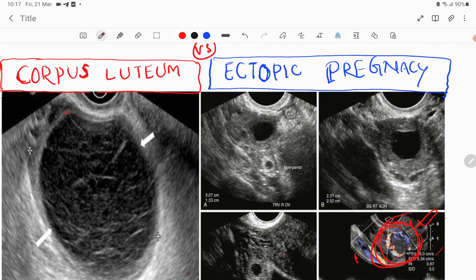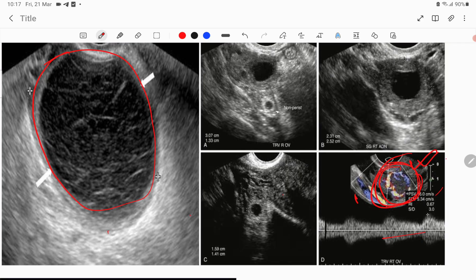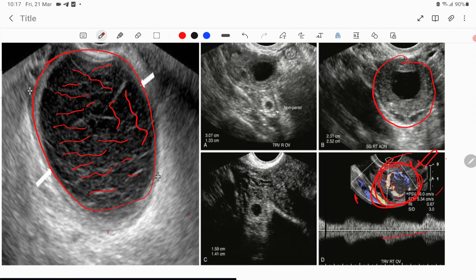Here you can see a corpus luteum with a ruptured hemorrhagic cyst — there is an interlacing hemorrhagic net-like pattern inside. Because of hemorrhage, there is a net-like blood clot pattern inside the cystic structure. You can also see an ectopic pregnancy with a thick, hyperechoic wall, compared to the hypoechoic appearance of a corpus luteum.